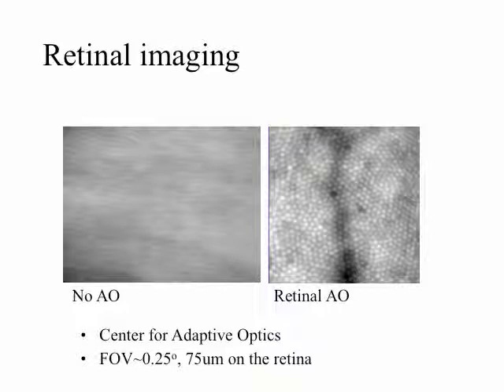It's likely that we're going to see adaptive optics as a subject of interest in ophthalmology going forward. And we also employ wavefront in potentially doing wavefront-driven refractive treatments to patients' corneas, and who knows, maybe at some point in the future to intraocular lenses too.